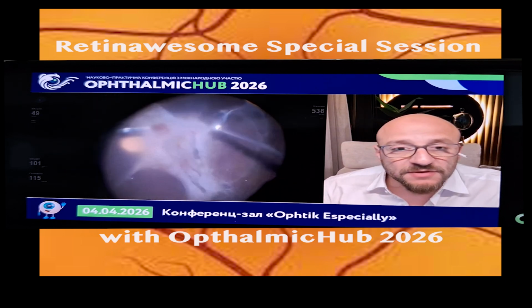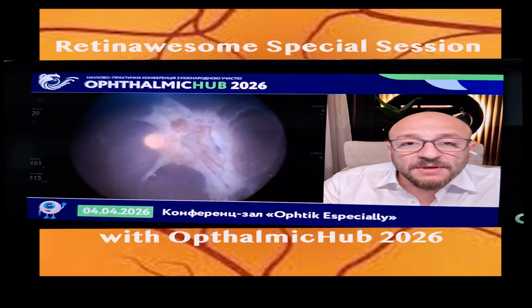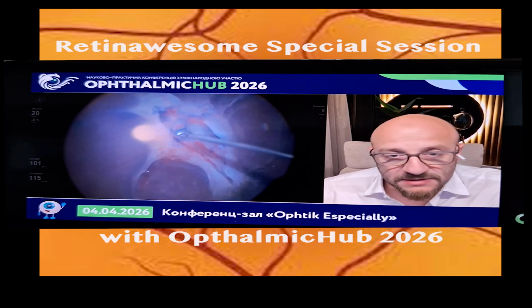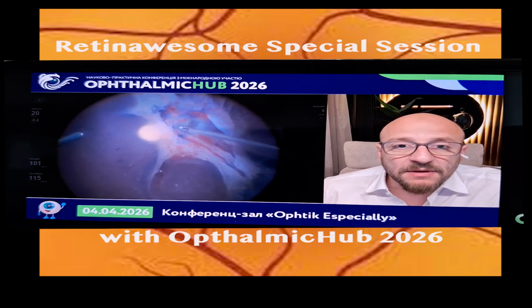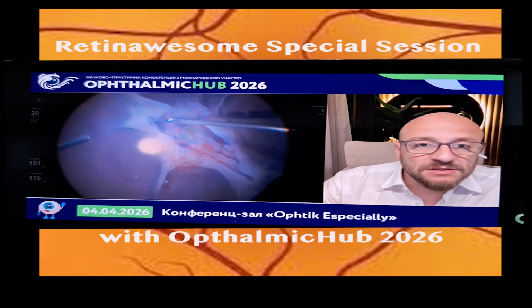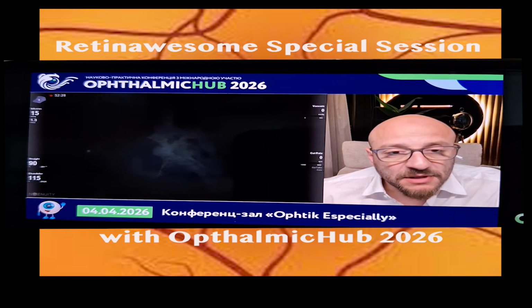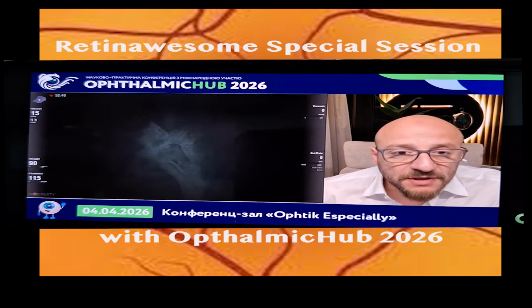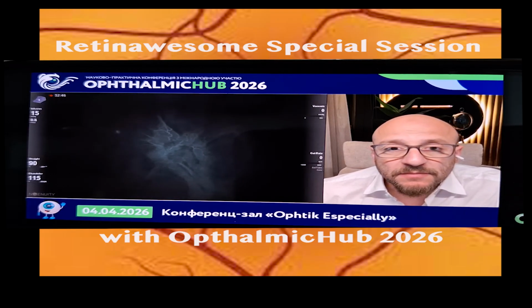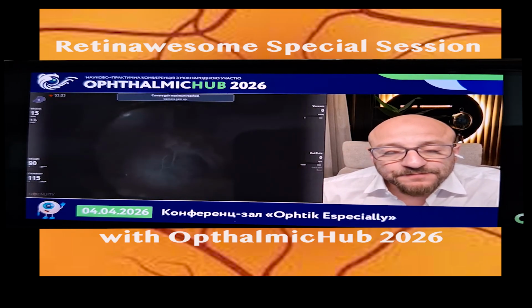I want you to take a mental picture of this because this is important to manage, and this is one of the important features of FEVR in general. And I usually remove the ILM just to make sure that there is no PVR over the posterior pole and no residual traction. And then I decided to do the intraoperative fluorescein angiography to confirm the diagnosis, and also to decide where the areas of the peripheral non-perfusion are.